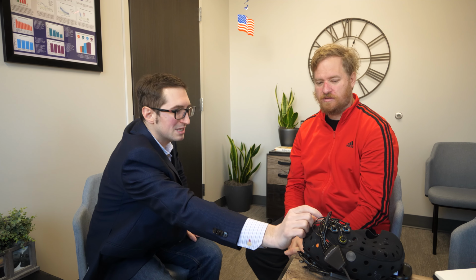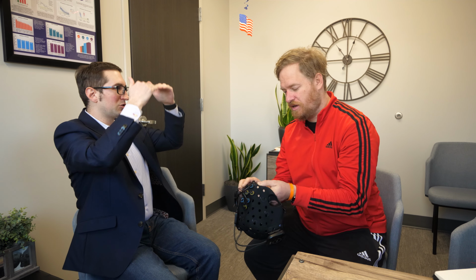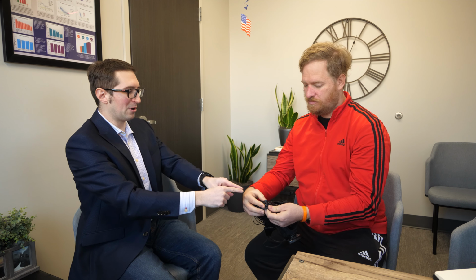Right. Which you can do by having, the shorter these channels are, the distances between the two channels, the closer it's going to be reading. So the further apart you get, the deeper the reading. You also get more noise and weaker signal. I was wondering why they're so spread out. Some of the standard in the field and the research is to have these things called short separation channels. Not always necessarily needed. There's still some thought, like if you're working on children, their skulls are pretty thin as it is, so you may not need it.